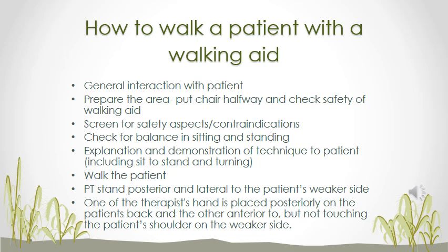Make sure that the floor is not wet where they walk. Are they walking with slops, flip-flops, where there's a chance that it's not as secure or they may fall or slip? Be sure that the area where they're going to walk and your patient is safe to walk.